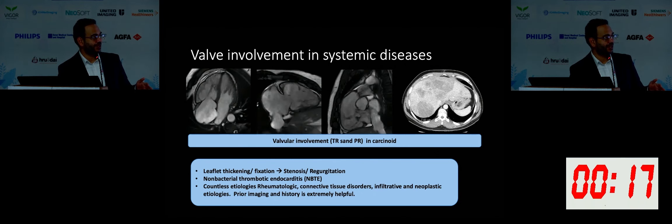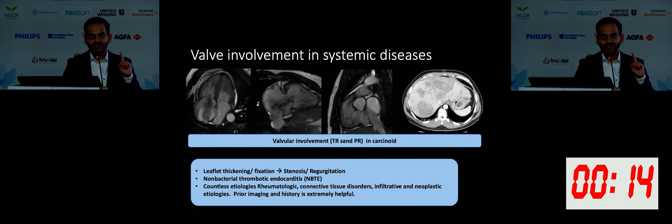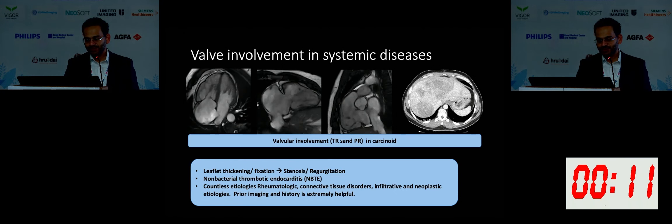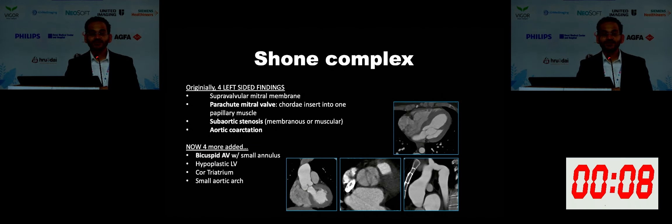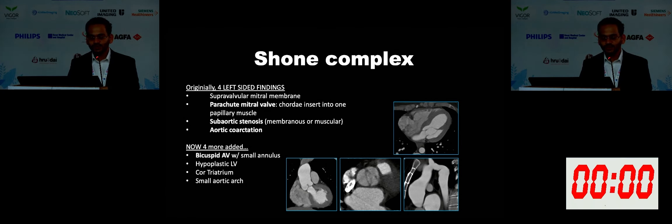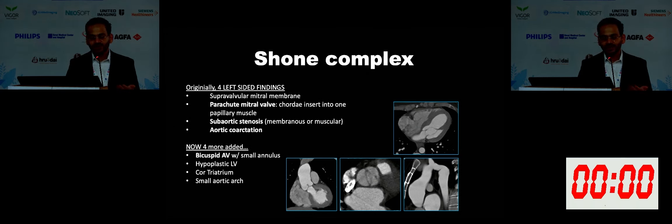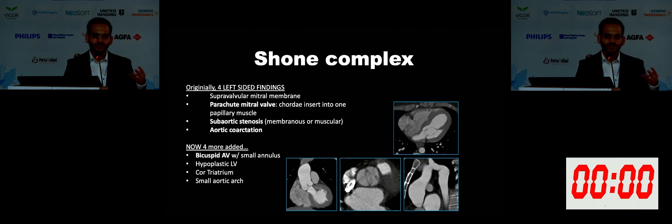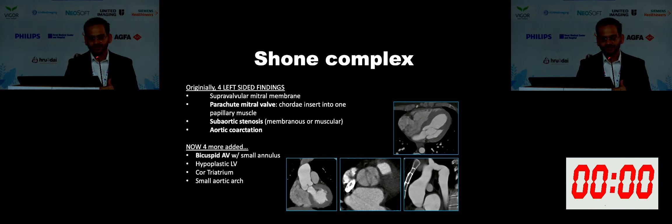I think I've shown most of the examples of valvular heart disease. I have one last case to show, and the diagnosis is beyond the valve, so you have to image with a larger Z-axis coverage. Here is an example of Shone's complex where you can see a parachute mitral valve with sub-aortic stenosis. You can have sub-aortic membranes and coarctation of the aorta. Recently we used to think that only four findings are associated with Shone's complex, but now we include bicuspid aortic valve, hypoplastic left ventricle, cor triatriatum, and small aortic arch along with Shone's complex.